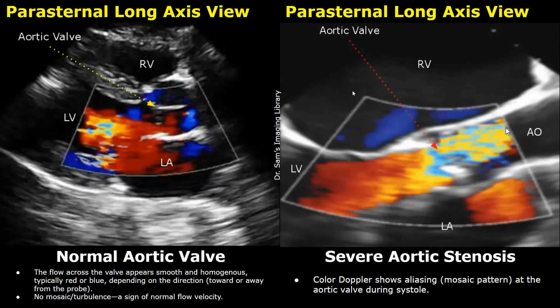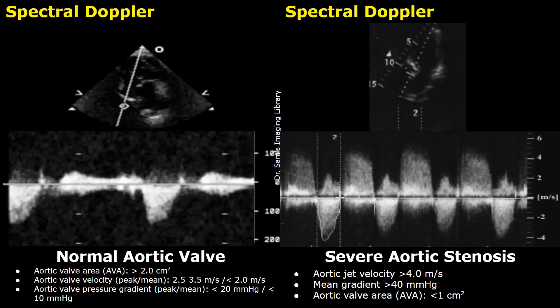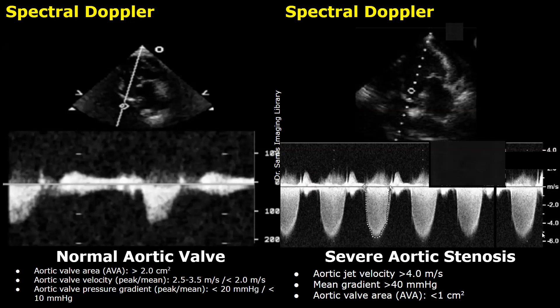In severe stenosis, the turbulence and mosaic pattern are very prominent. This type of color mixing is very commonly seen in severe aortic stenosis. On spectral Doppler, the aortic jet velocity is greater than 4 m/s — here it is almost 5 m/s. The mean gradient will be greater than 40 mmHg; in this case it was 53 mmHg. The aortic valve area is less than 1 cm². Additional cases shown also demonstrate peak aortic jet velocity greater than 4 m/s consistent with severe aortic stenosis.